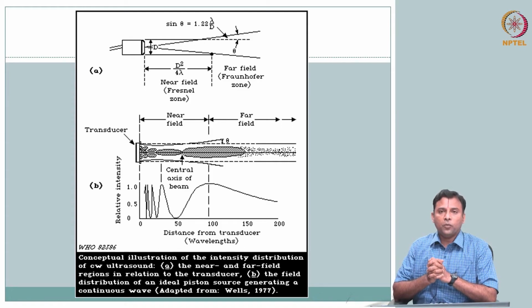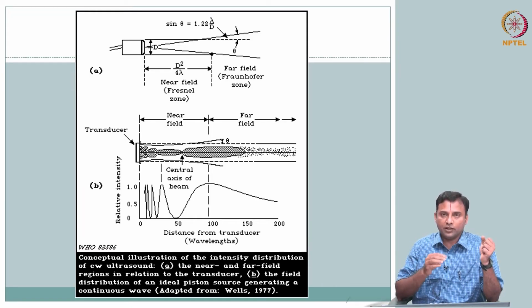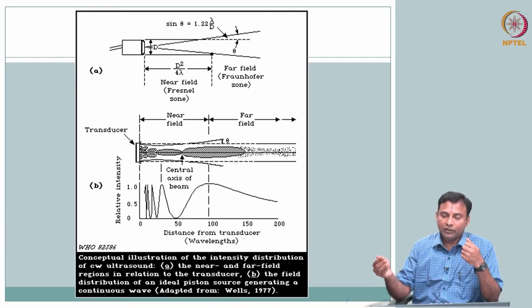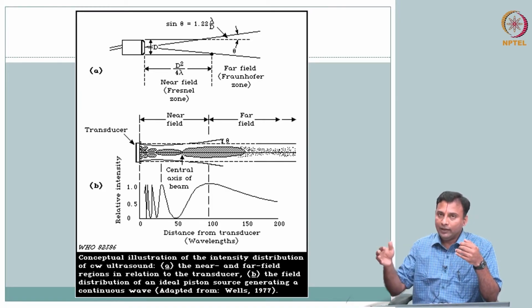Okay. So, what we have covered thus far is we started with instrumentation, and one of the major components in the instrumentation of an ultrasound system is your transducer, which, as we saw, acts as both a source. You can generate pressure waves as well as receive them. On one side you can supply an electrical quantity, it creates a pressure wave, and on reception we talked about how we will be using it in pulse echo mode, which is what is predominantly used for medical imaging applications. So, when the pulse goes in, it bounces back.